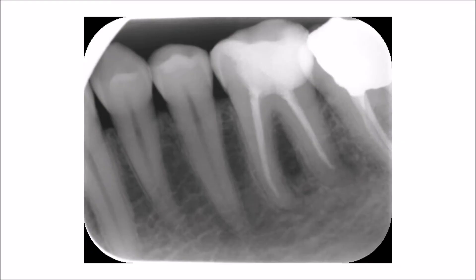In this periapical radiograph, which shows the premolars and a molar tooth, we want to understand the correct way of measuring the distance between the alveolar crest and the cemento-enamel junction. Before we start measurements, we need to identify the points where we will take our measurements.